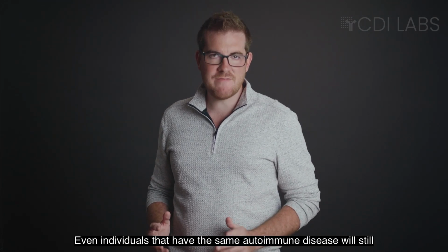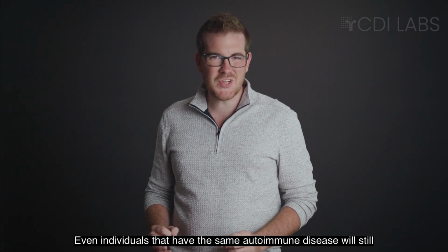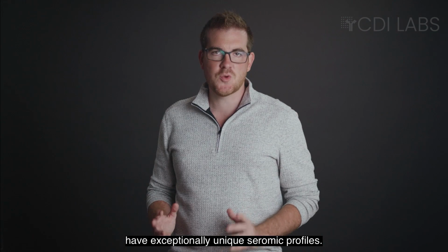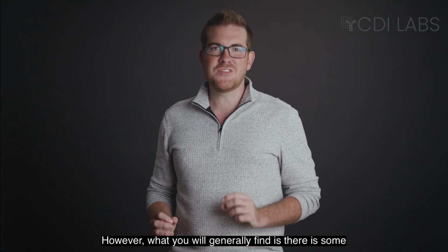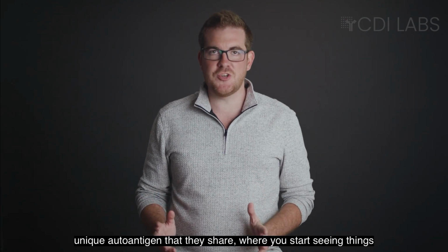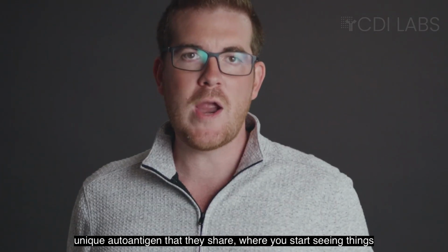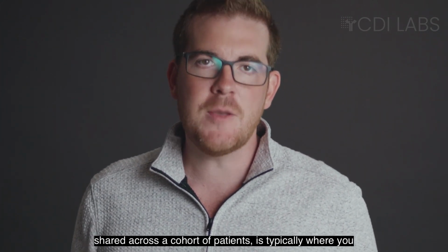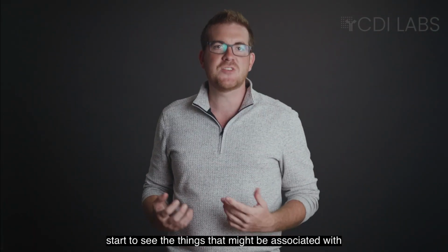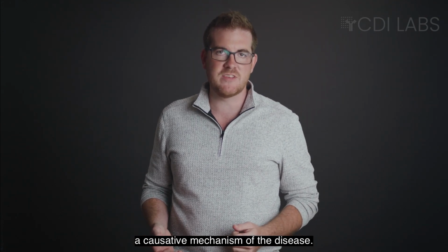Even individuals that have the same autoimmune disease will still have exceptionally unique seromic profiles. However, what you will generally find is there is some unique autoantigen that they share. Where you start seeing things shared across a cohort of patients is typically where you start to see the things that might be associated with a causative mechanism of the disease.